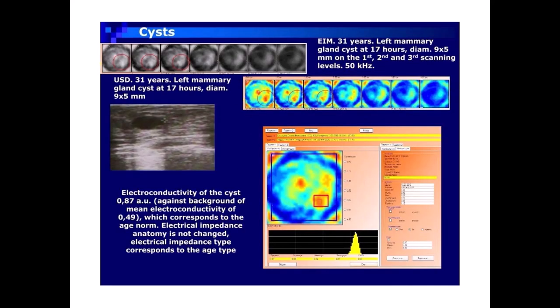Cysts EIM case: 31 years, left mammary gland cyst at 17 hours, diam. 9x5 mm, shown on the 1st, 2nd, and 3rd scanning levels at 50 kHz. Ultrasound: 31 years, left mammary gland cyst at 17 hours, diam. 9x5 mm. Electroconductivity of the cyst: 0.87 AU, against a background of mean electroconductivity of 0.49, which corresponds to the age norm. Electrical impedance anatomy is not changed; electrical impedance type corresponds to the age type.